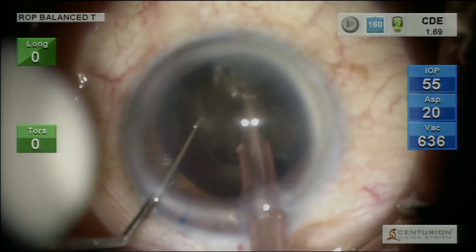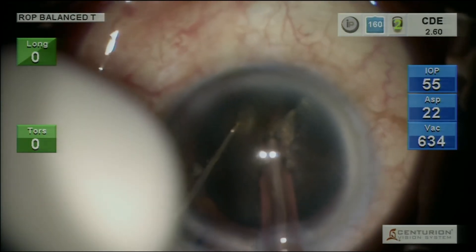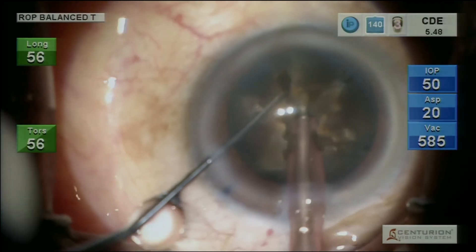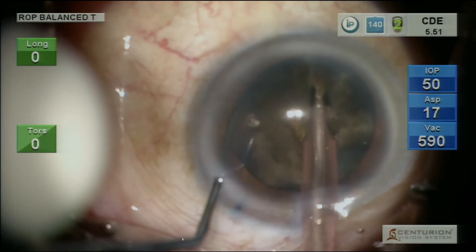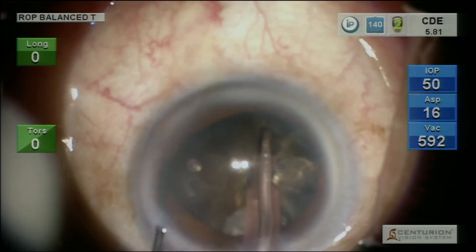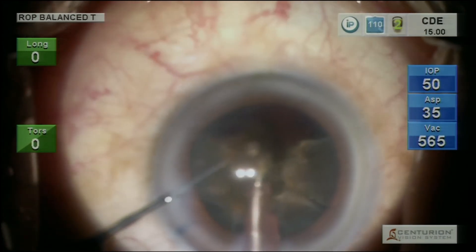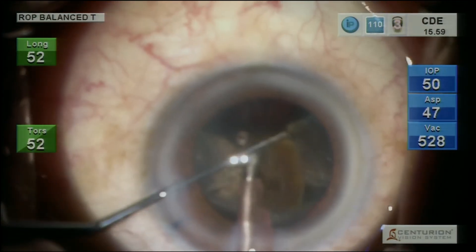This can be achieved if you do it rightly. Use the chopper of choice — as you can see in this case it's a pointed chopper, 1.5 or 1.75. The most important thing is how you hold it. Then horses for courses — see the chopper I have changed. You can have adequate cleavage planes without any issue using not the longitudinal phaco but the Ozil mode. You can see how adequately it has been separated. Next is how to take care of the endothelium — see the chopper scaffold, how the chopper is being taken all around so that no nucleus piece touches the endothelium.